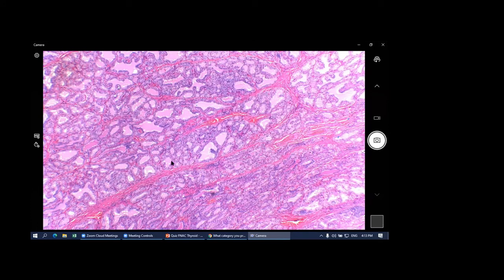But that depends on your operator. If your operator sucks quite well and the specimen is good, it's okay. But there's always a discrepancy once in a while. So you need to look a lot and learn from it.